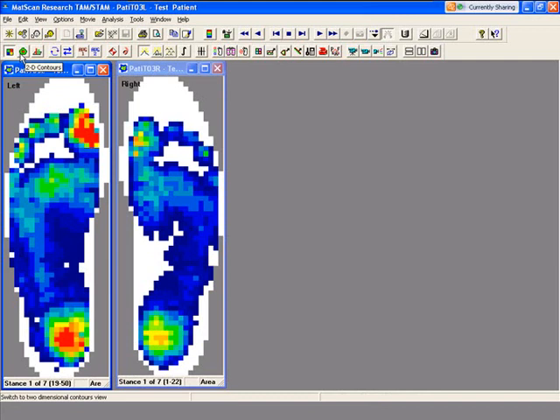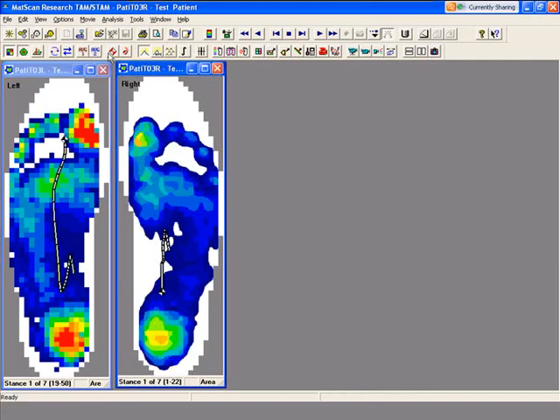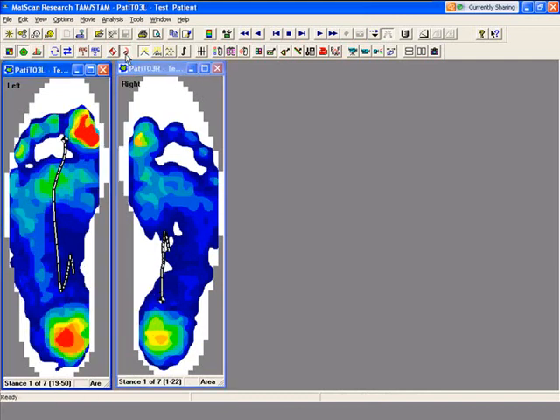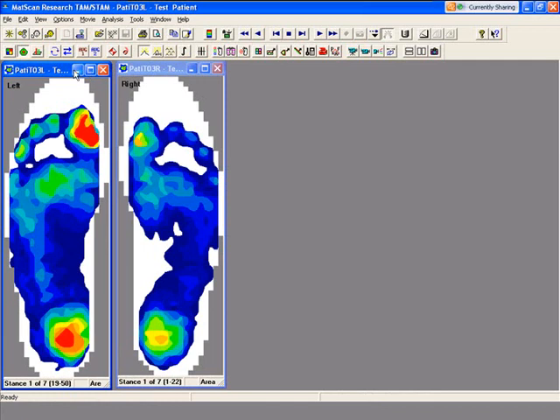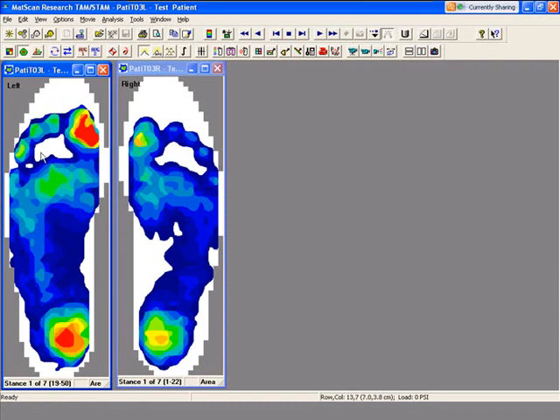That's a self-smoothing program algorithm which will get rid of those rough corners and make the sensing cells look more like the natural foot. Now everything's been smoothed out and you can see the landmarks a little bit better.